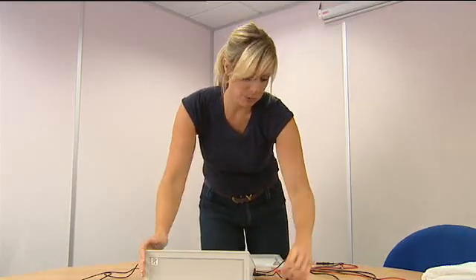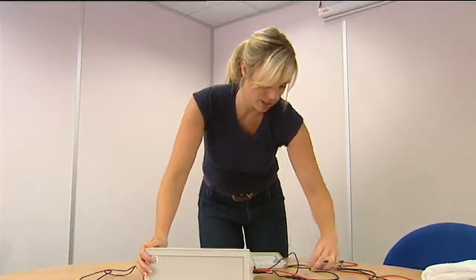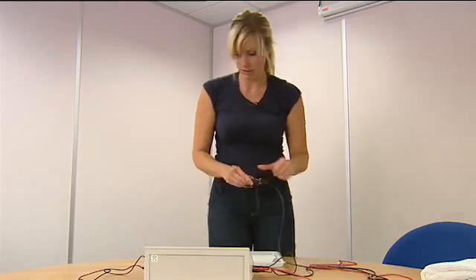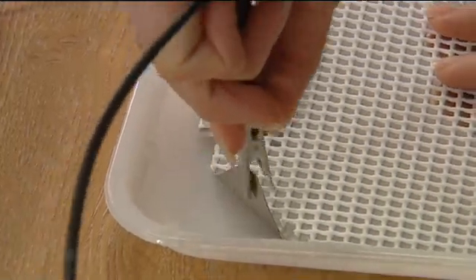Plug the leads into the corresponding colour sockets on the left hand side of the machine, and then attach the crocodile clips to the upturned corners of the electrodes.